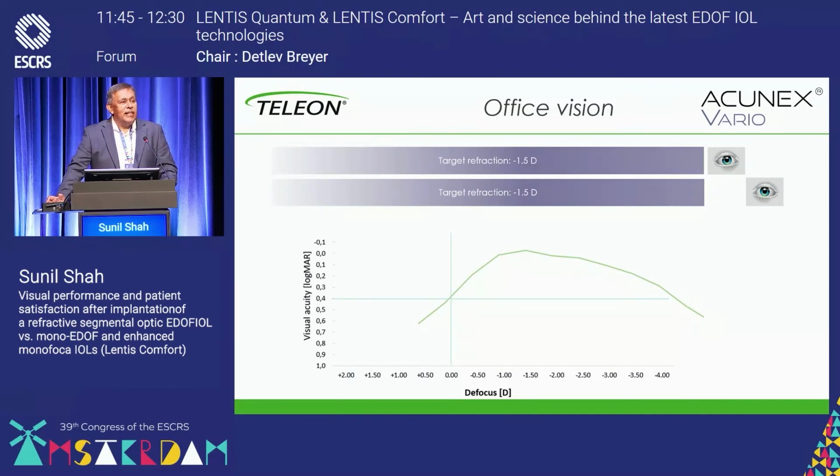So you give them a range of 1.5 to 3. So yes, the distance vision is at the 20/40 range, but that's perfectly adequate for day-to-day living. Again, driving glasses, but they will be completely free of the need for near vision.